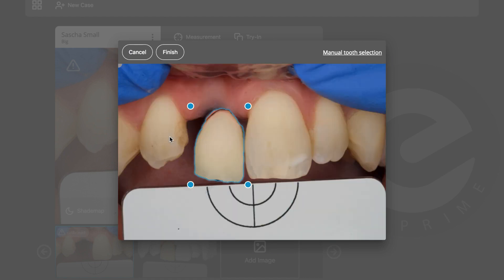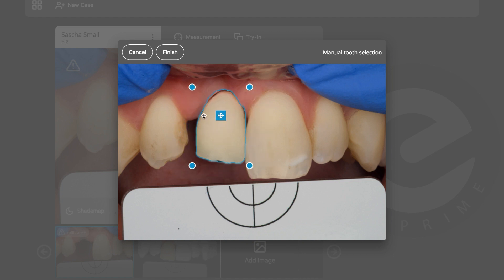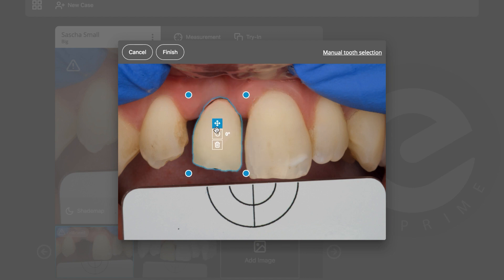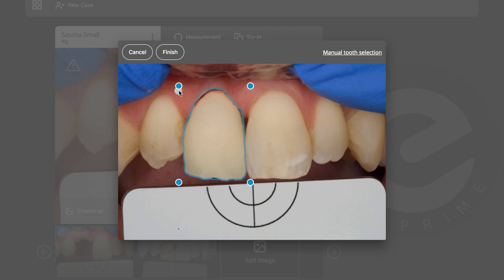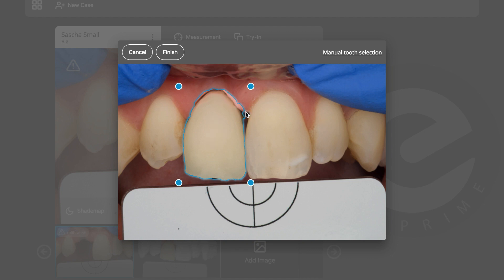It will automatically cut the tooth from the model. I can move the picture around with the first button, rotate the tooth if needed, delete it, or make it bigger. I can also rotate it back, extend the area, or delete it. Once I'm happy with the position, I'll click Finish.